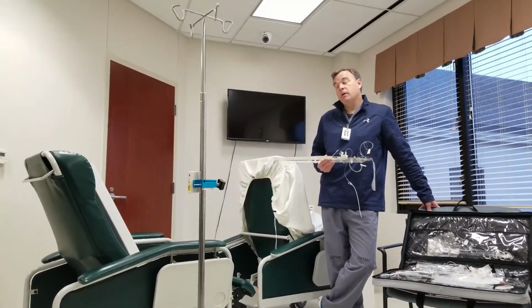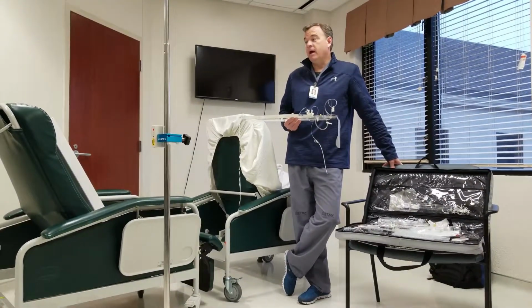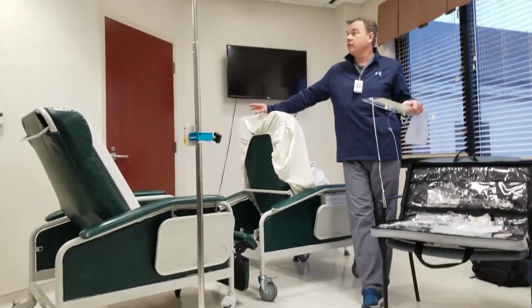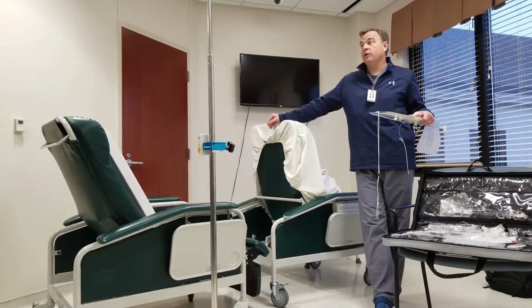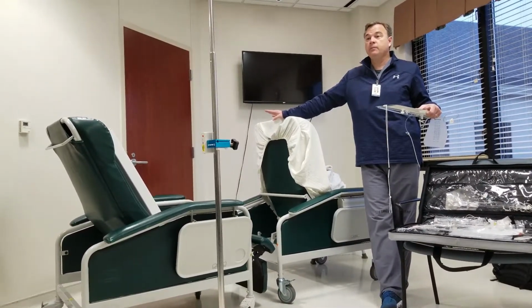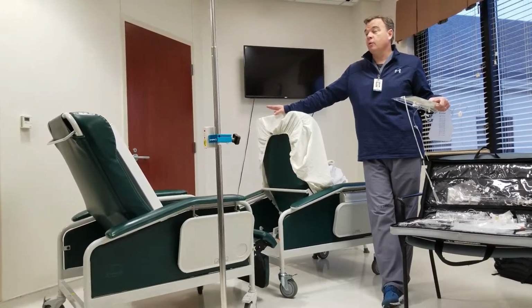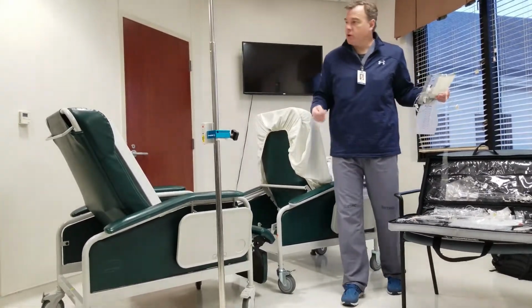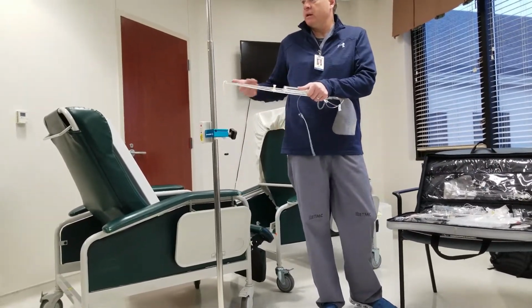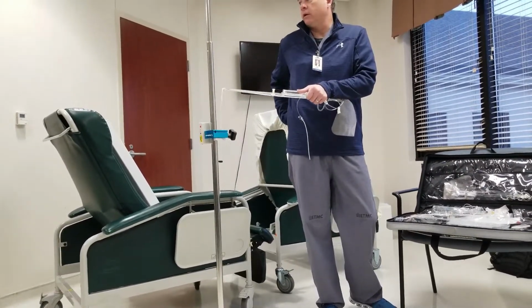Typically, if the surgeon, Matt or Dr. Pelosa, comes up here getting ready and says, "I want to take this out," and the patient doesn't have a Foley in, first and foremost they should go to the bathroom. The thought process is that a little trocar put this catheter into that space, so in essence you've made another puncture hole in the dura.